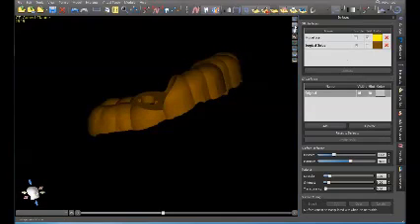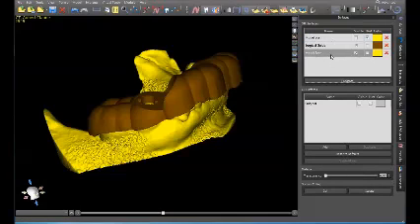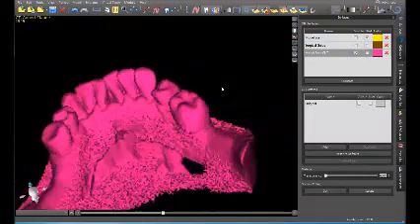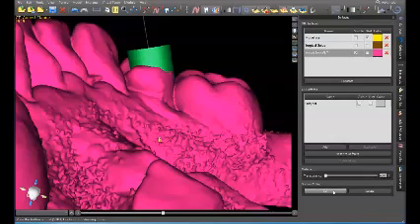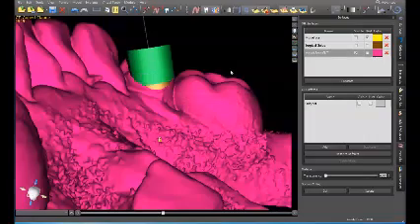So what we'll do now is save all this data, but go back into model scan. And I like to duplicate this model and we'll just use this model scan cut. We'll change our color to pink. Turn off this guide. So what we'll do in this one, which is a little bit different, we'll turn back on the implant guide tube, and I'll come from the lingual aspect and click on surfaces, cut, and I'll hold down shift while I'm clicking the left button, and we'll essentially virtually extract this tooth from the lingual aspect. Let's see what that looks like.